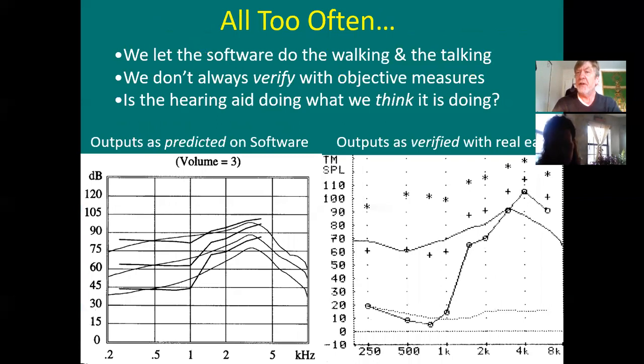You can see it. And then you run the hearing aid, and you've programmed it for DSL5 or NAL 2 or NAL 1. So you program the hearing aid according to one of the fitting methods. Then you go on to Real Ear, and you choose that fitting method, and then you verify, is the hearing aid actually truly programmed to deliver? So you're matching targets as seen on Real Ear, and usually on the software, it looks pretty good.